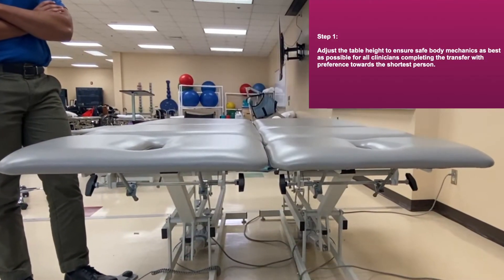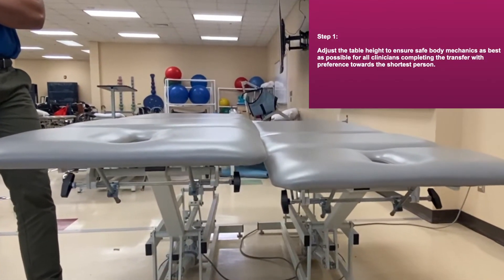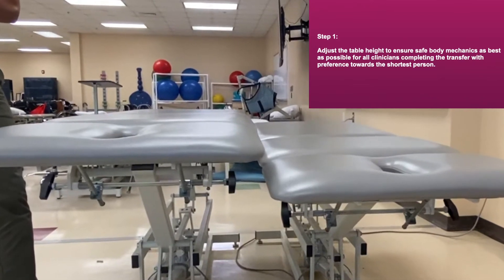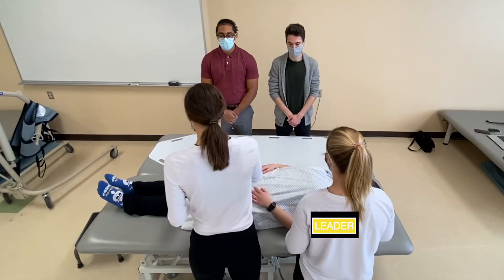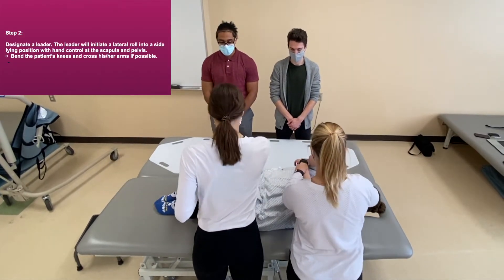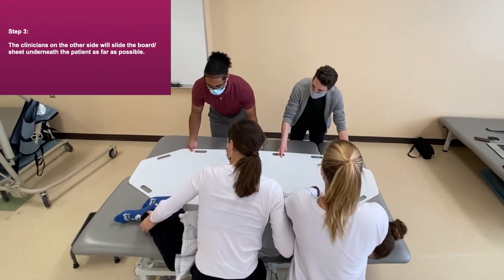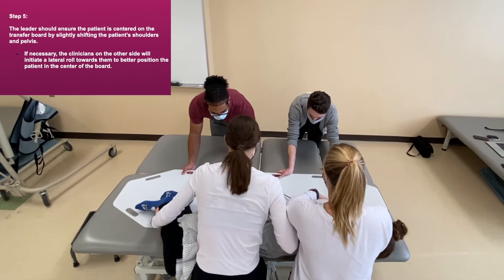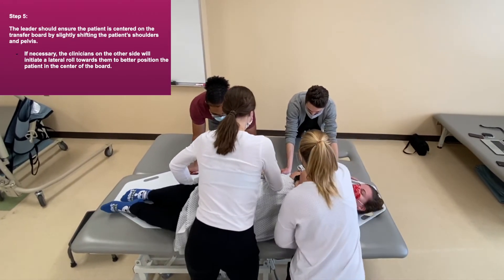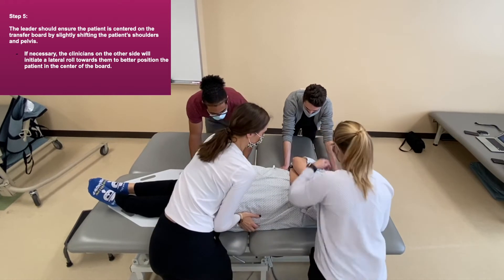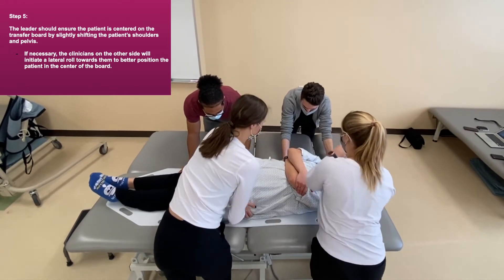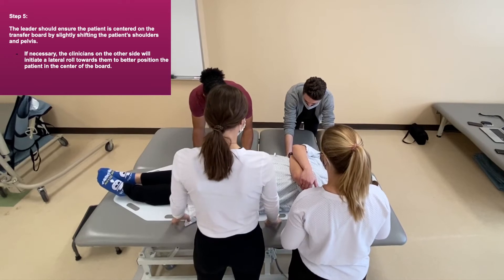Adjust the table height to ensure safe body mechanics as best as possible for all the clinicians completing the transfer, with preference towards the shortest person. Designate a leader. The leader will initiate a lateral roll into a sideline position with hand control at the scapula and pelvis. If possible, bend the patient's knees and cross his or her arms. The clinicians on the other side will slide the board underneath the patient as far as possible. The leader will carefully roll the patient back into a supine position on top of the transfer board, and should ensure the patient is centered on the transfer board by slightly shifting the patient's shoulder and pelvis.